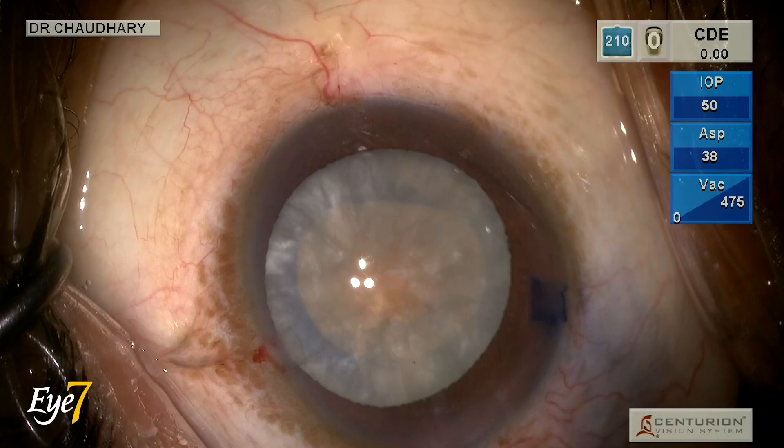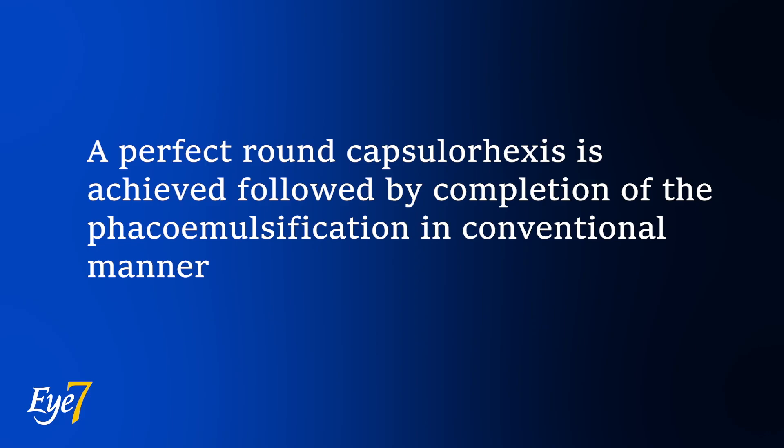As we can see, a round CCC is achieved without any rhexis runout or Argentinian flag sign.